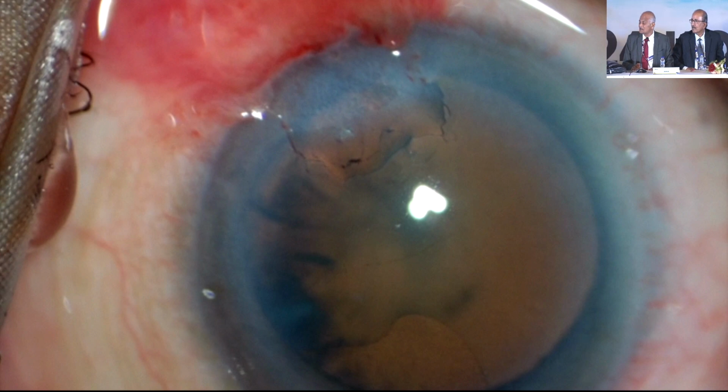Now, this is the vitreous in the anterior chamber. This is the second case I want to present. Is that a vitreous in the anterior chamber, no? No, sir, this is a different case. That was vitreous.